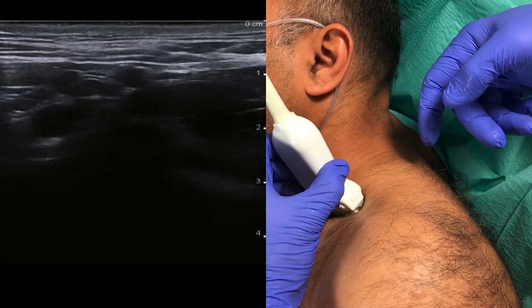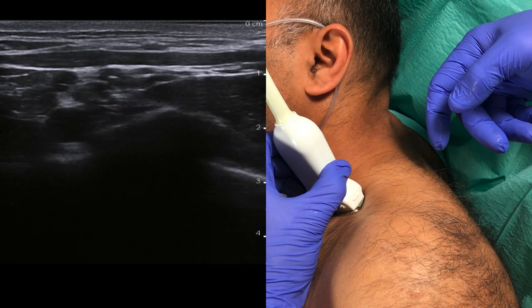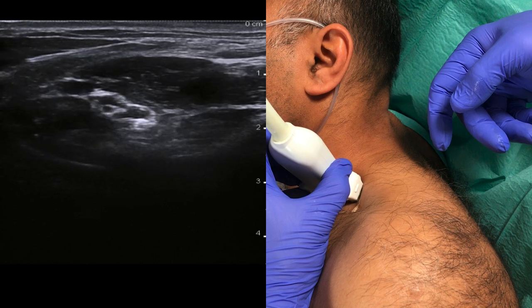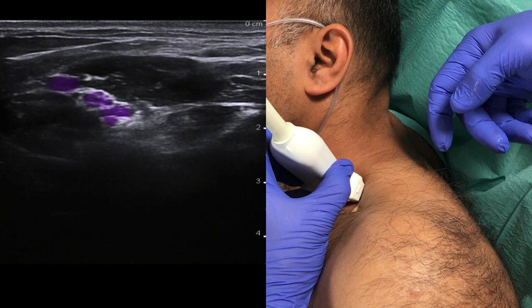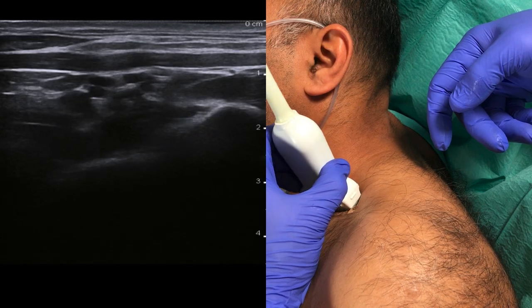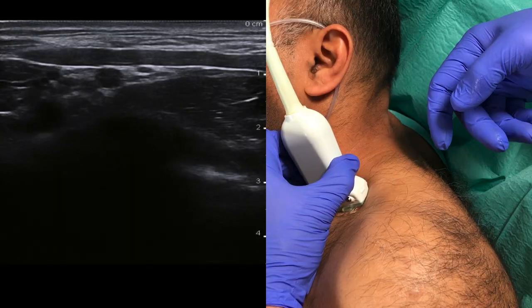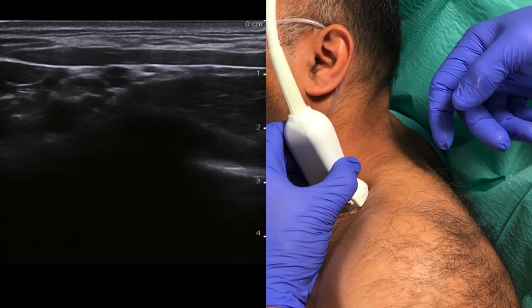Identify the pulsating subclavian artery, here marked in red. Tilt the transducer slightly cranially to identify the brachial plexus, here marked in purple, in the interscalene groove. Trace the nerves back to the supraclavicular position in order to visualize all the branches, which we've here marked in purple.